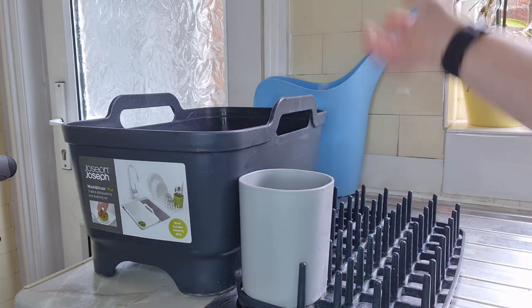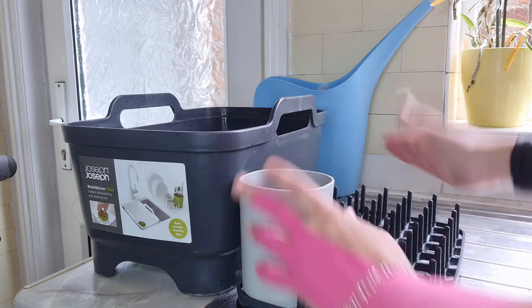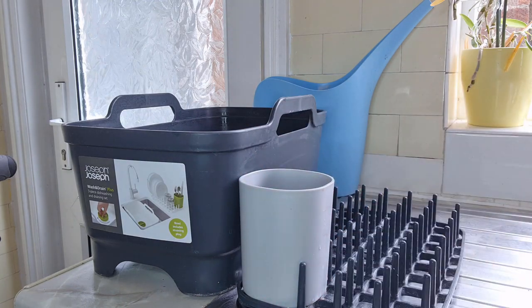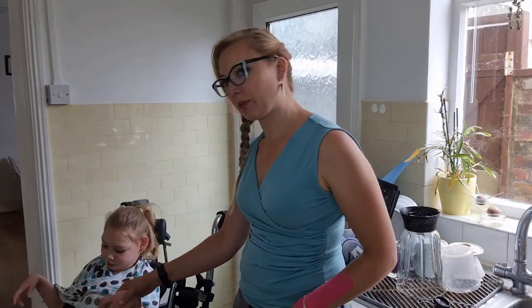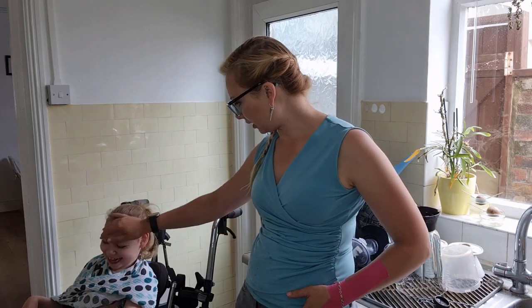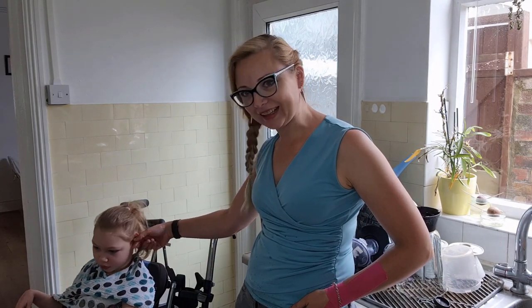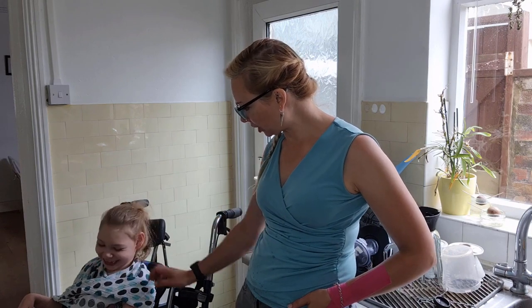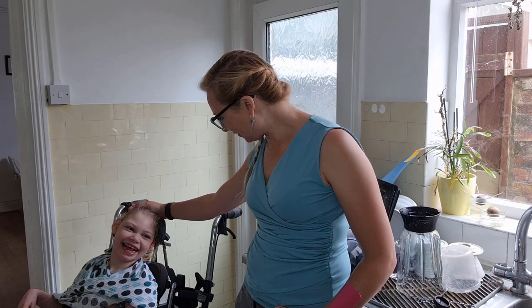Personally I chuck them in the bucket — works for me. I usually tend to wash up my syringes when I wash up the rest of my dirty dishes. Eileen's sitting here laughing at me. Hi girly, are you a happy child?